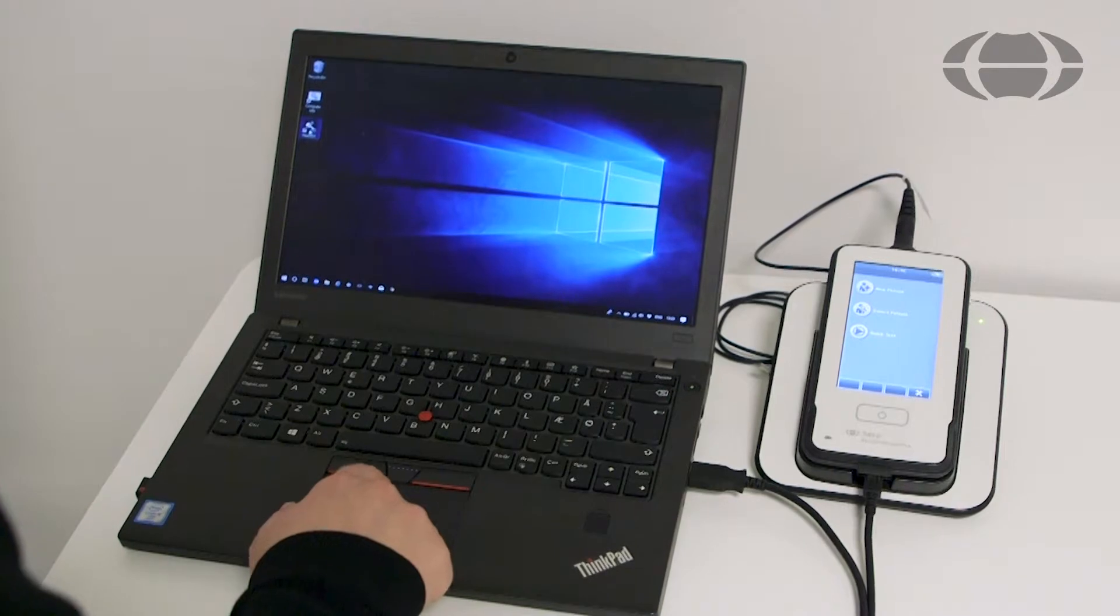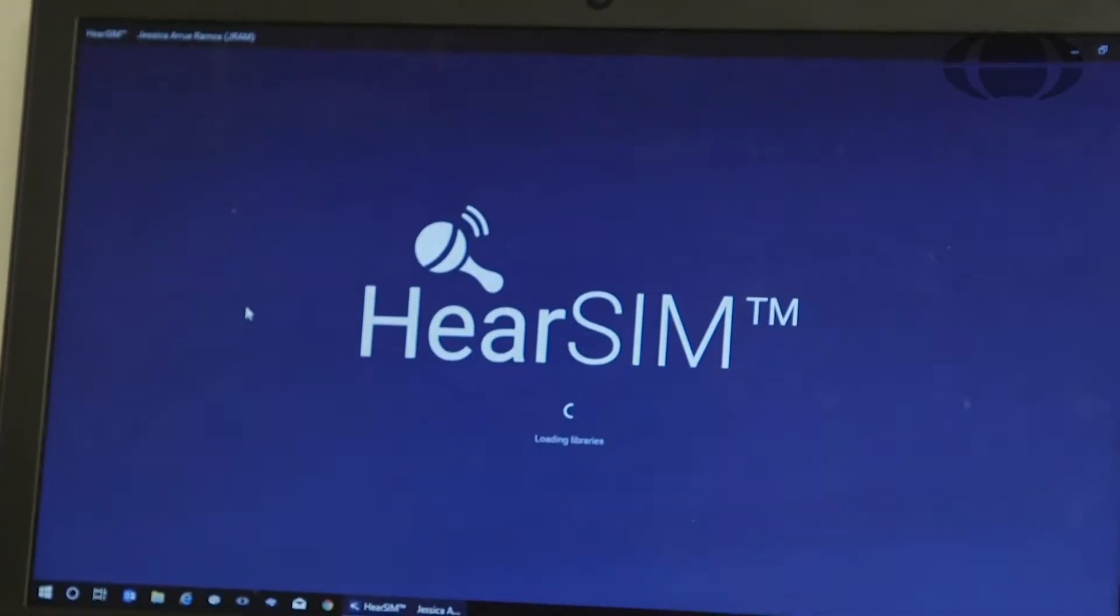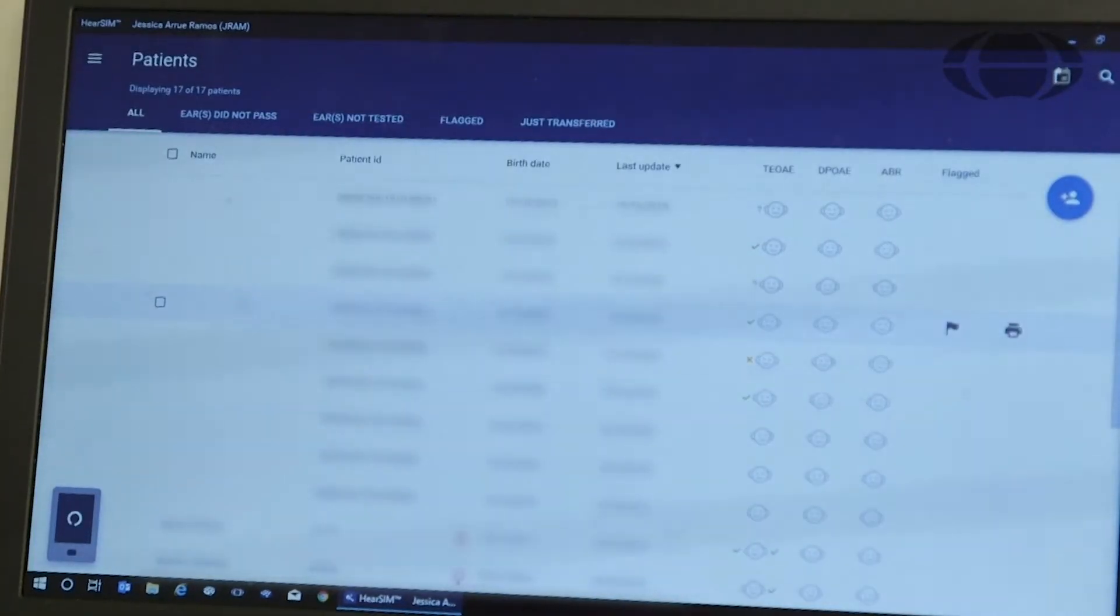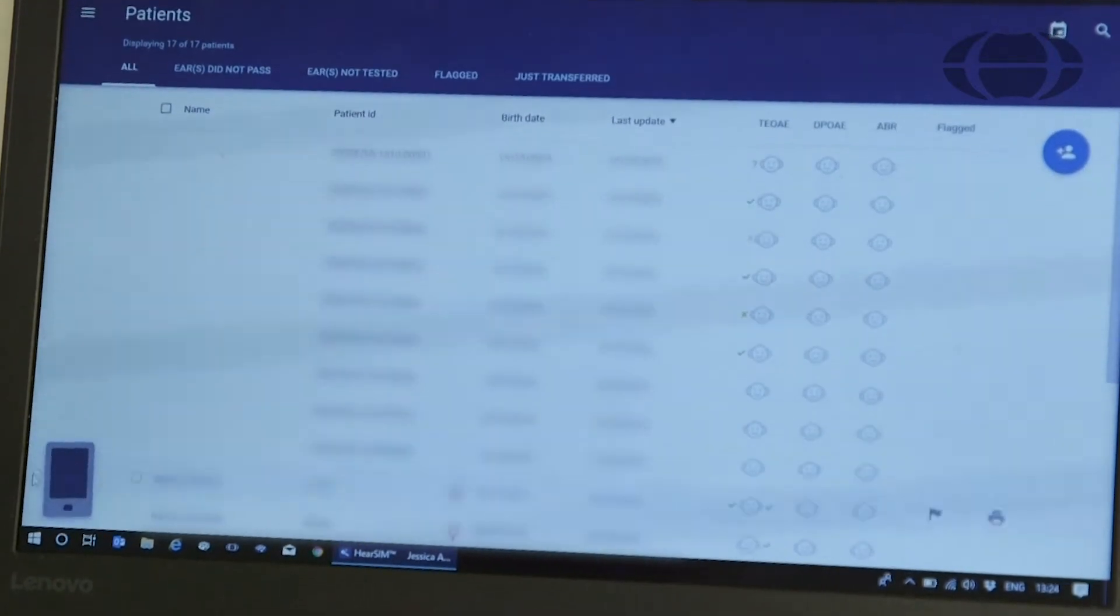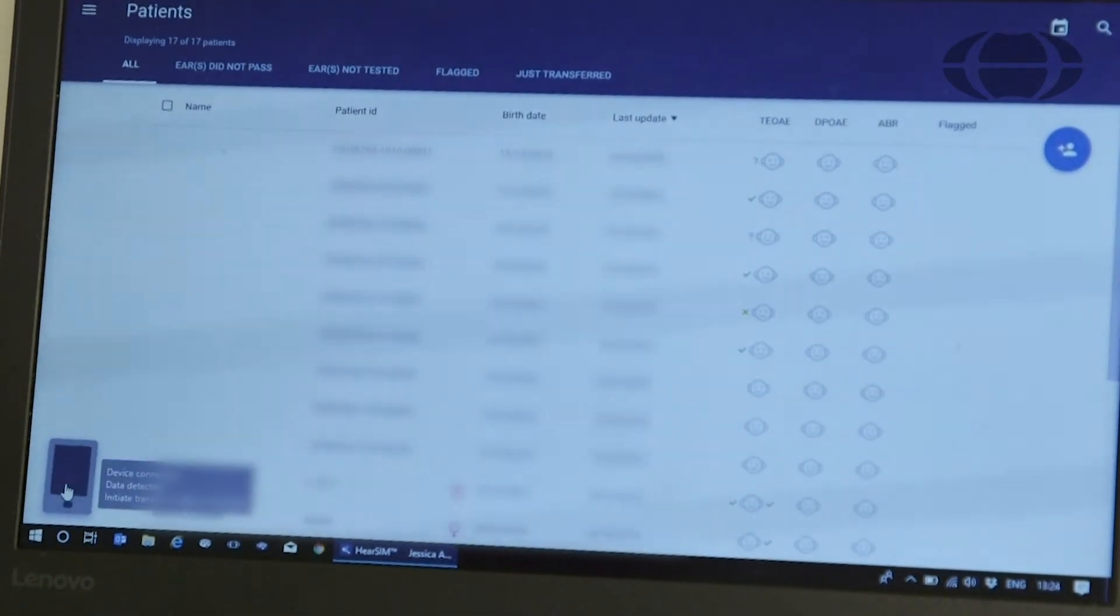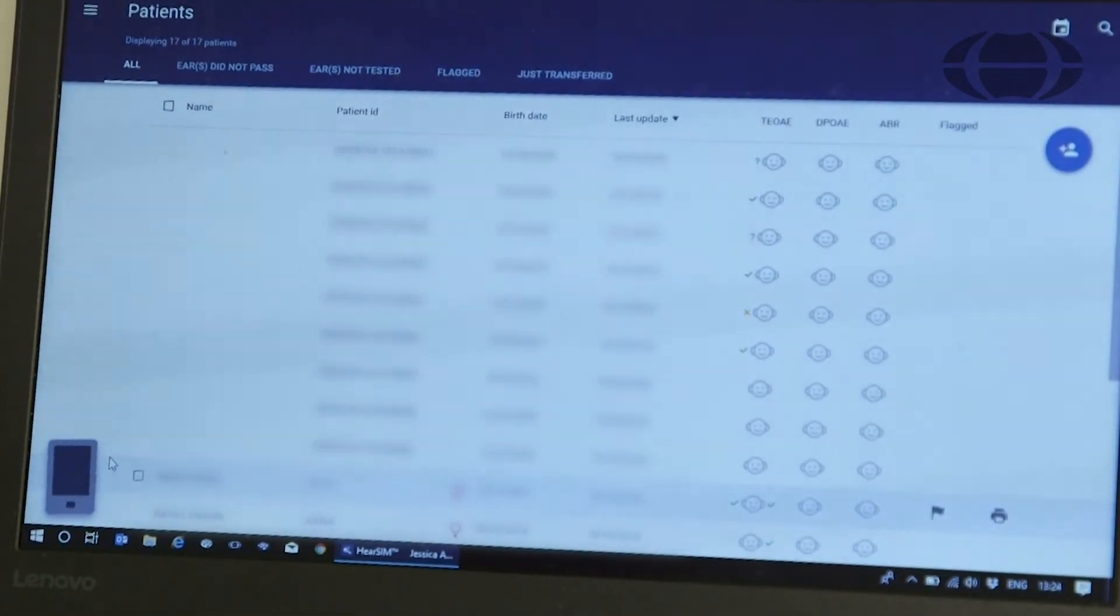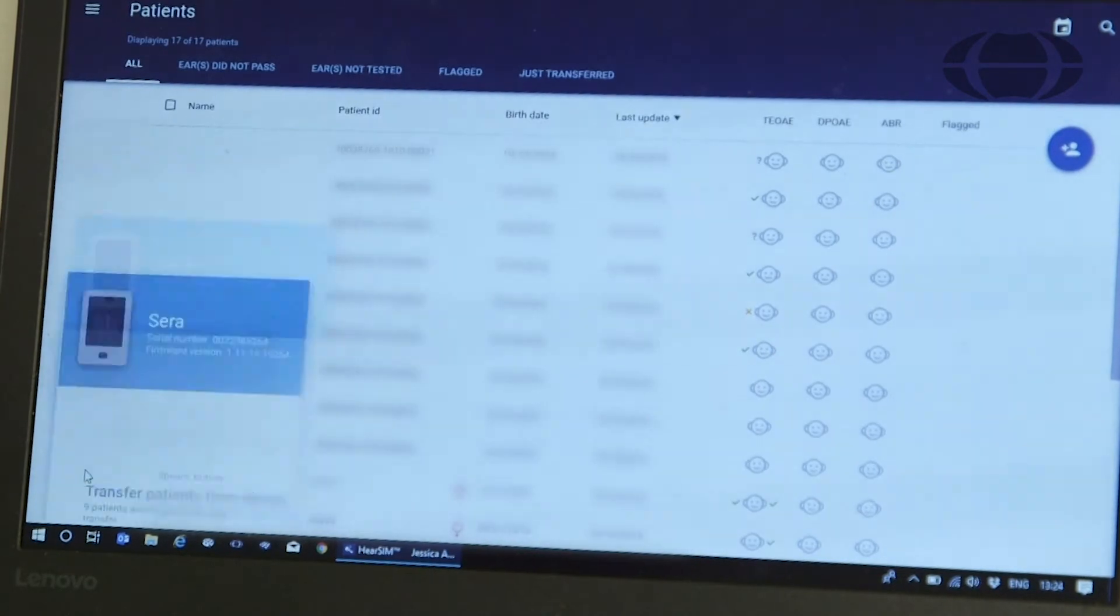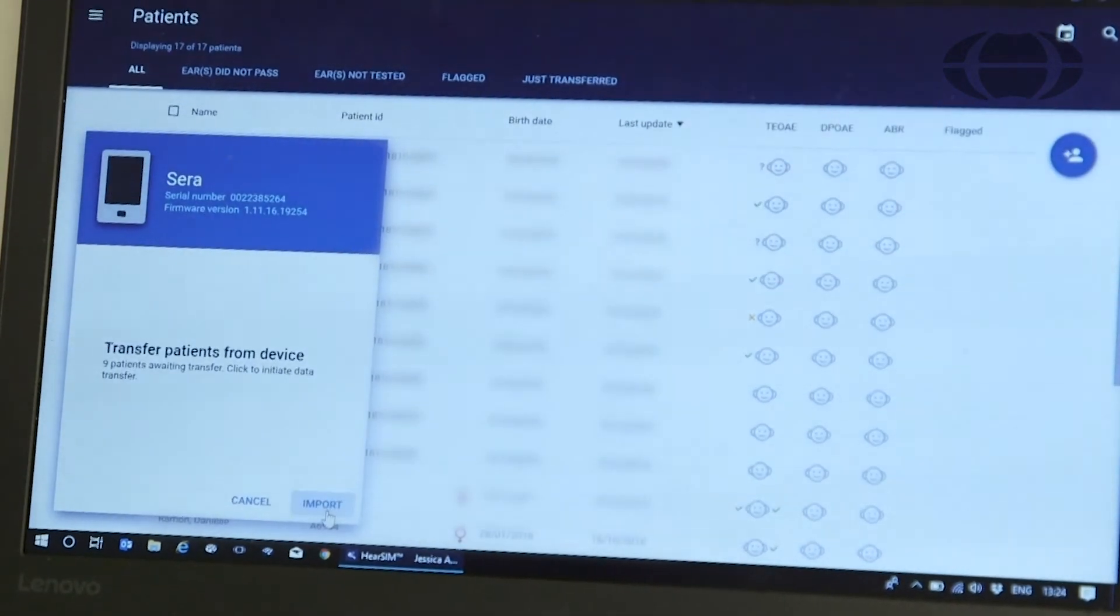Launch the hearSIM software and you will see a small Sera device icon wiggling at the bottom of the screen. Click on the device and click import.